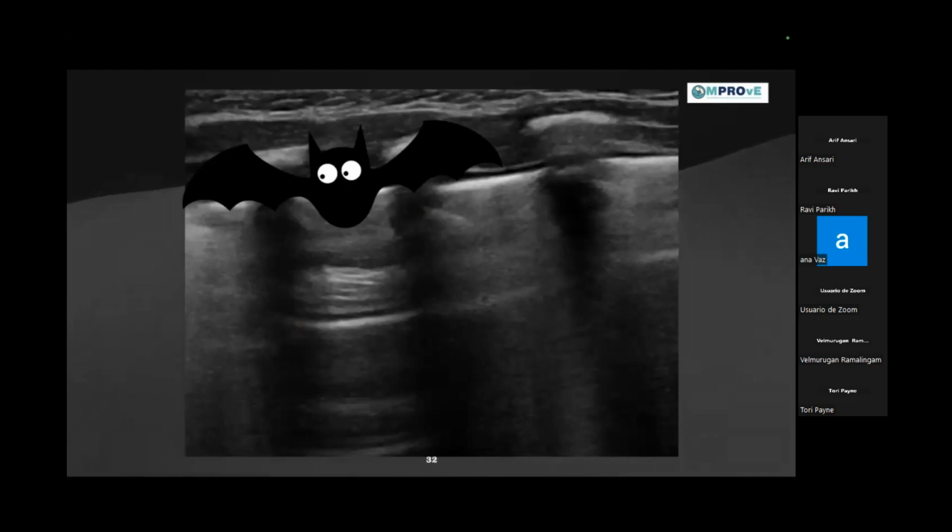So which one am I interpreting? Which image am I interpreting? Am I getting the right image or not? Is it a well aerated lung, or, with a change in the angle of the probe, does it look more like a dense lung? So what am I saying? To correctly interpret, to take that observer effect out, or to know that you are at the right angle on the pleura, you have to be absolutely bang on the right angle, 90 degrees over the pleura. How do we know that? You have to be able to see the bat wing sign.